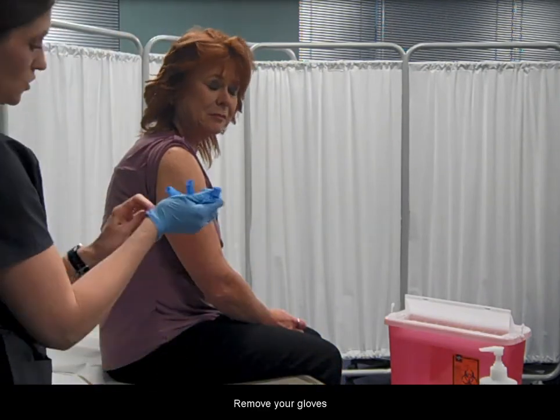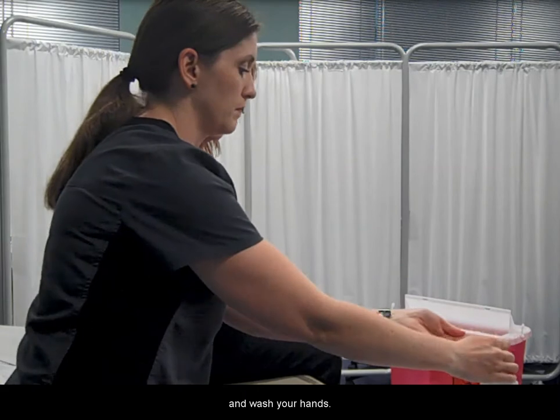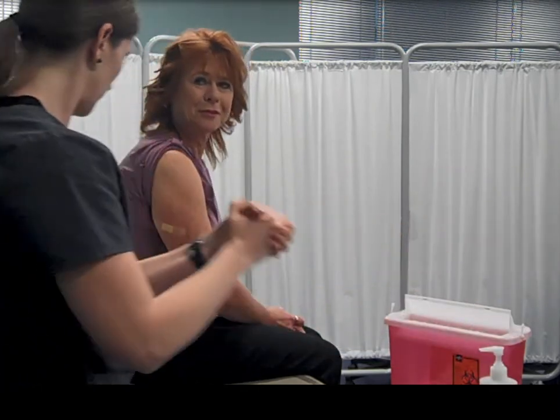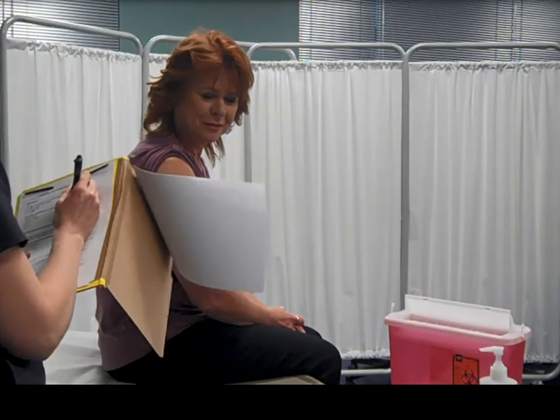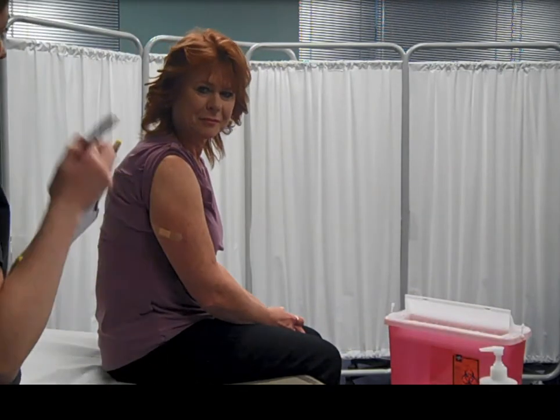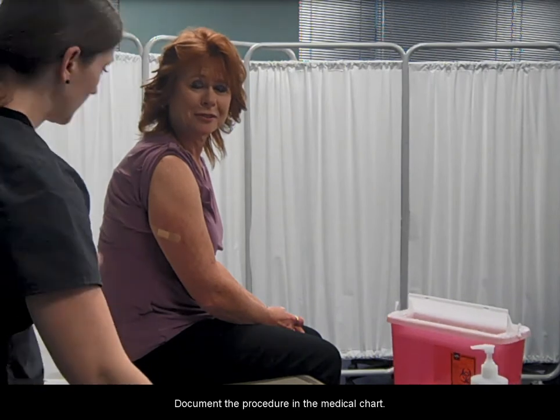Remove your gloves and wash your hands. Document the procedure in the medical chart.